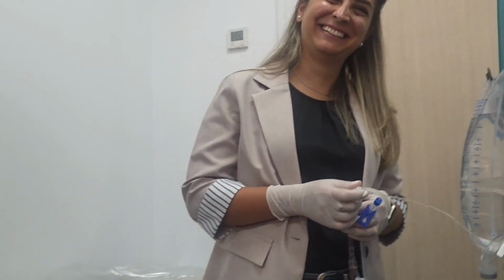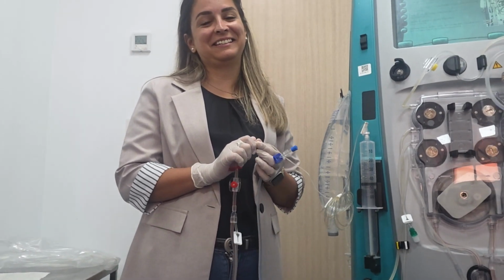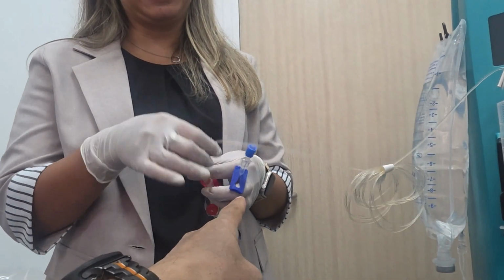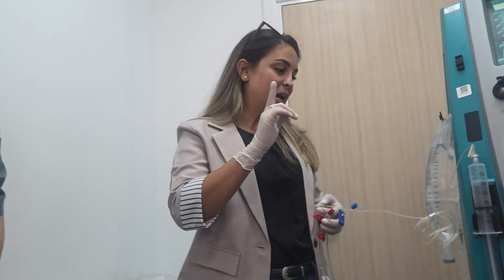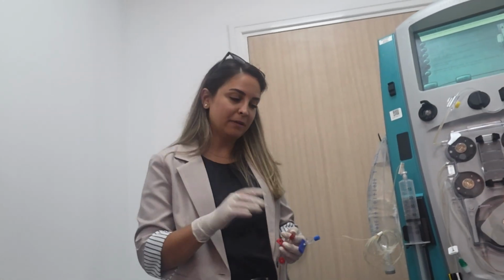Okay, look at this. For the purpose of preventing central line contamination, you can make the return of the calcium go to that three-way access, high flow, back to the patient. Then we can use our central line for the rest. That's the high flow, same diameter, the big one. Yes, that's for CRRT.